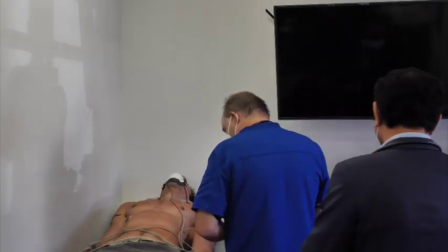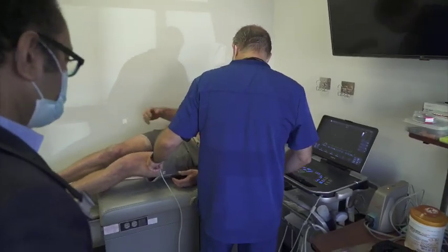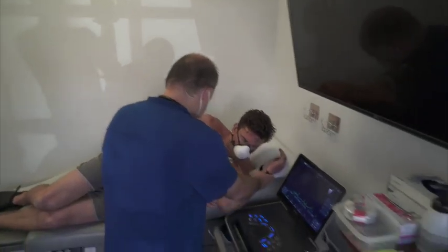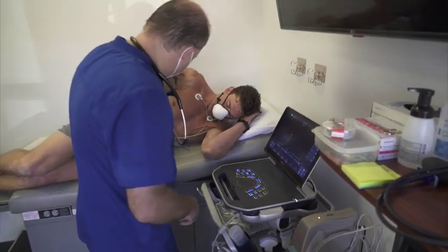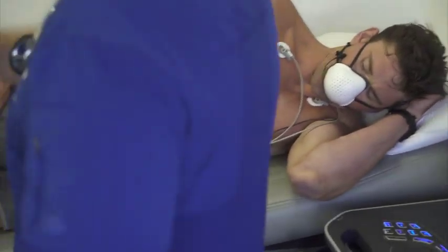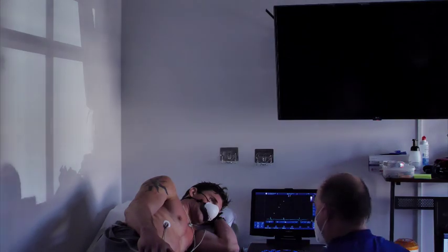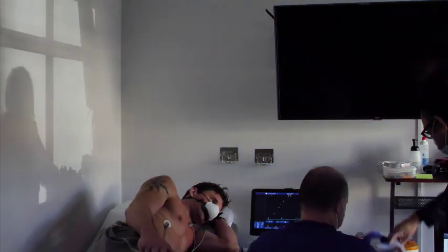We're going to roll you over a little bit on your left side so you're facing toward me. Get that left arm up and get you into a nice comfortable position — your best Titanic position. And if we don't mind, production, if we could kill the lights just behind you there. Thank you, that's a lot coming in.